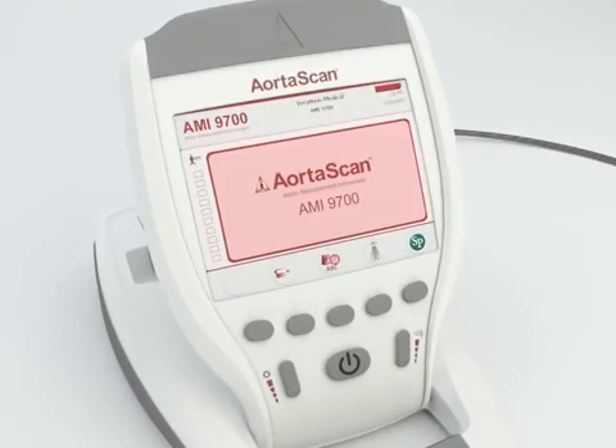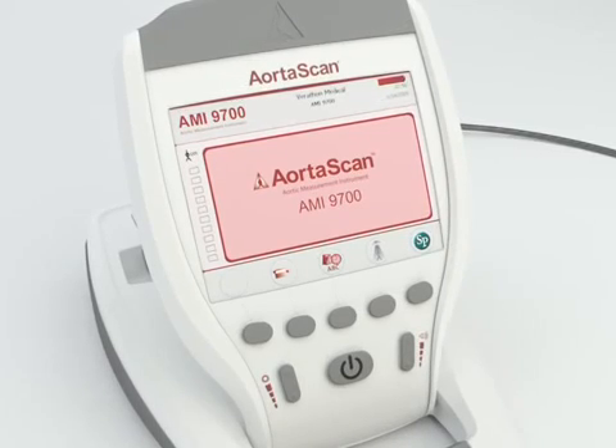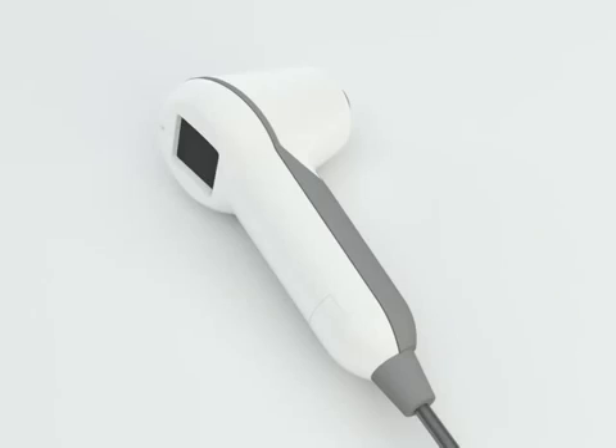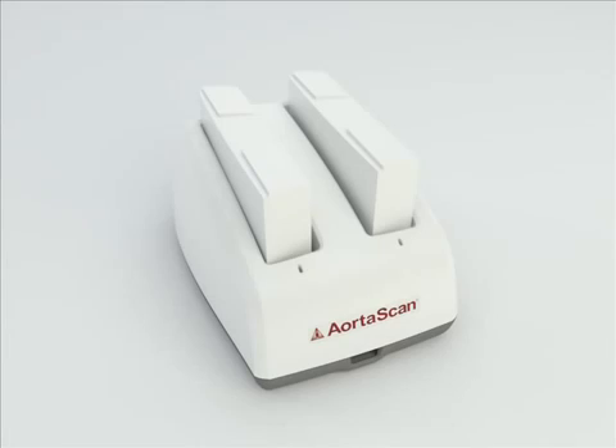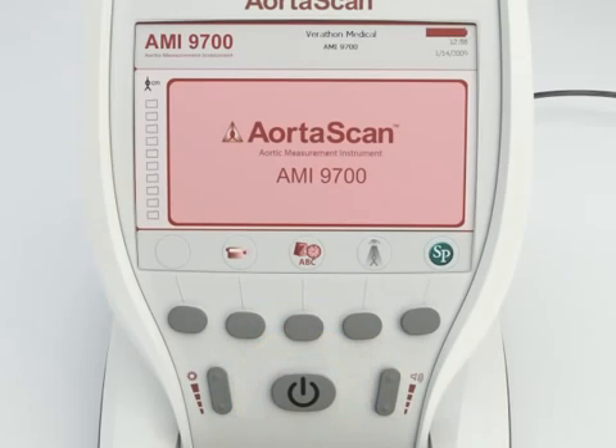The AortaScan AMI-9700 consists of a battery-operated color display console, a handheld ultrasound probe that scans the patient's aorta, and a combination battery charger and wireless hub. Turn on the unit by pressing the power on-off button.